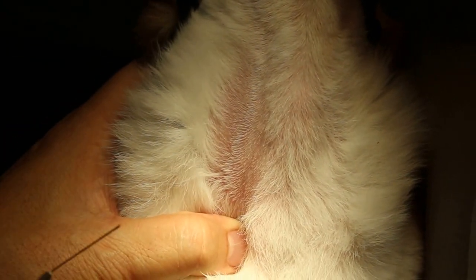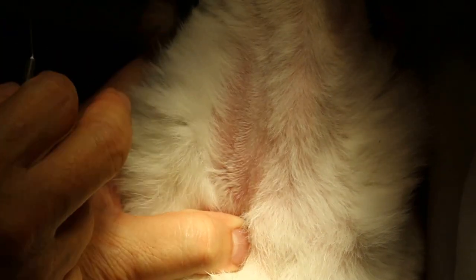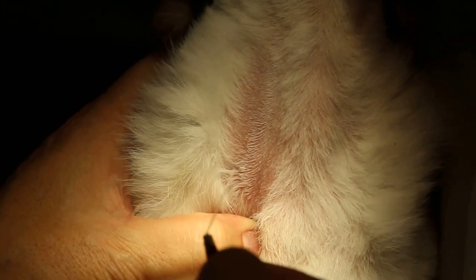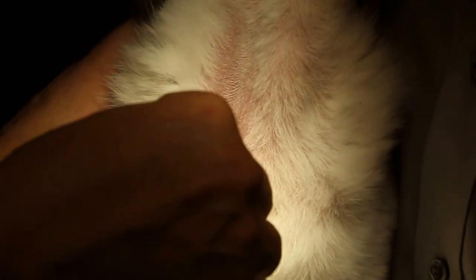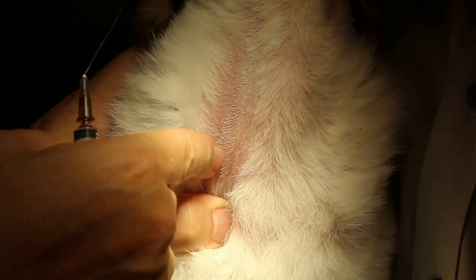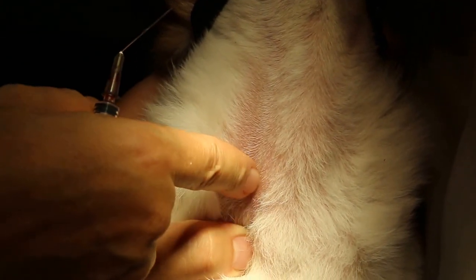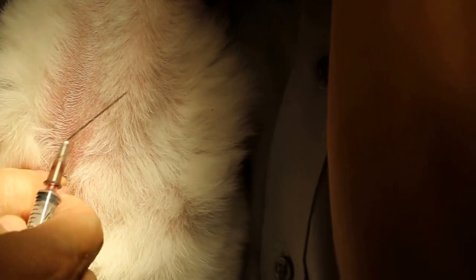I'm just demonstrating — of course the blood has been taken already. The assistant holds the dog firmly to his chest. This needle is angled, 22g, it is angled, and then it goes into the... there's a bit of swelling here. There is the jugular vein. This is the jugular groove. Because it's been taken already, I won't be taking again — so it goes in.